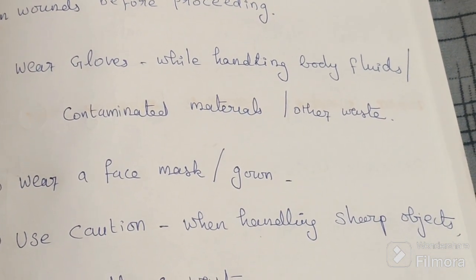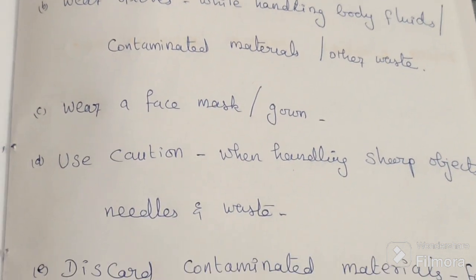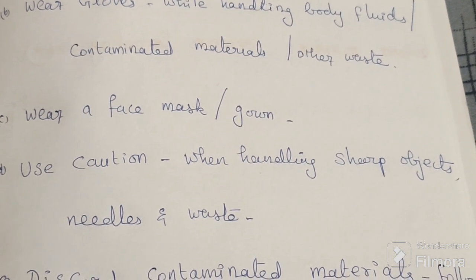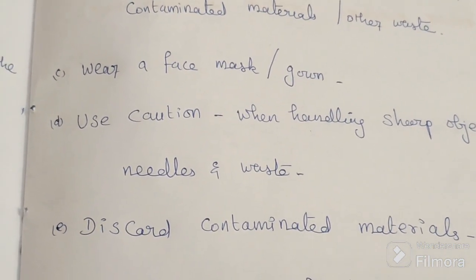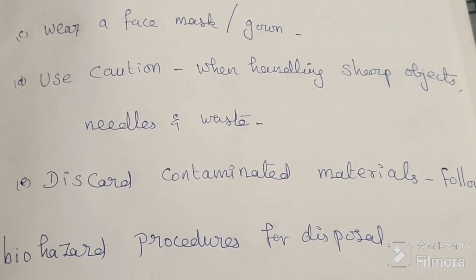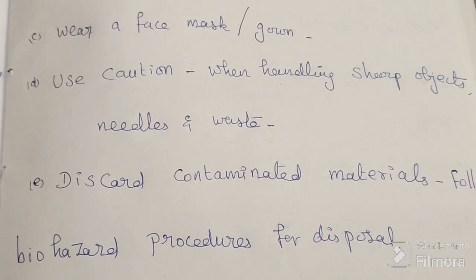We want to avoid needle stick injury. So use caution when handling sharp objects, needles and waste.